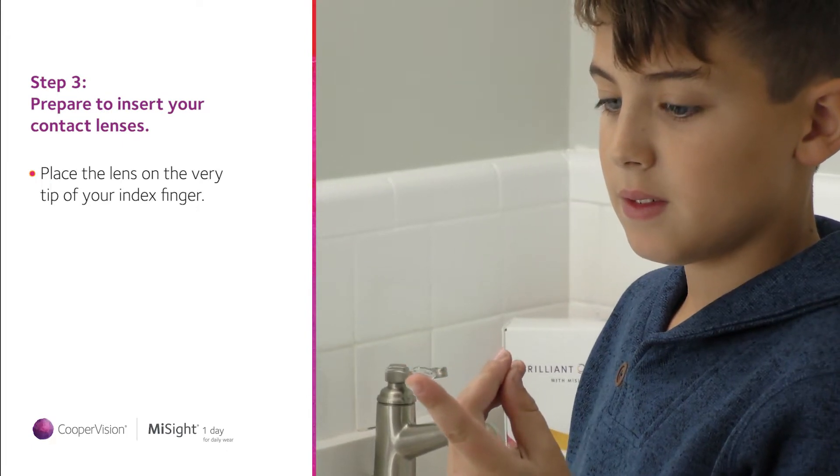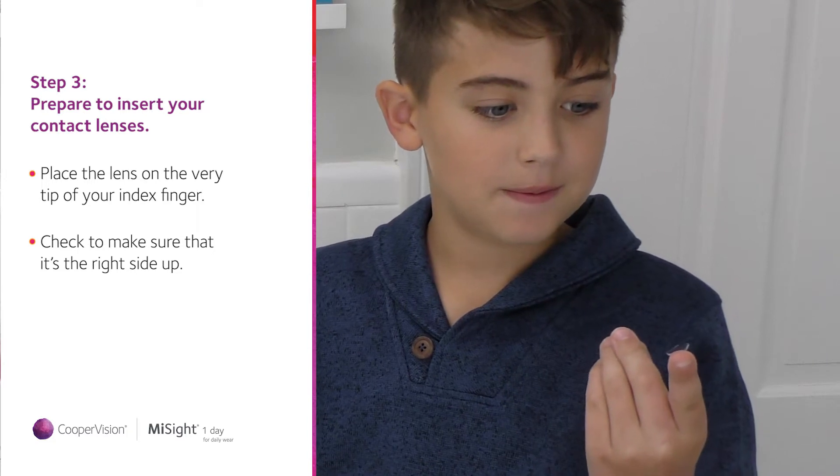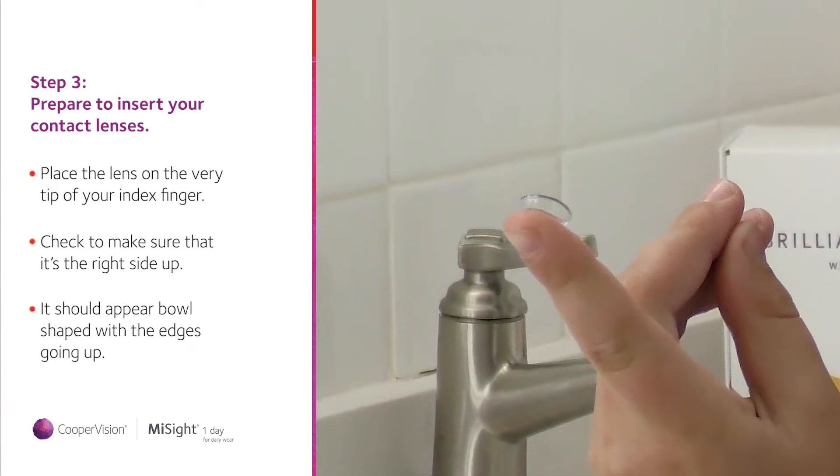Place the lens on the very tip of your index finger. Look at the lens to make sure that it's the right side up. It should look like a bowl sitting at the tip of your finger with the edges going up.